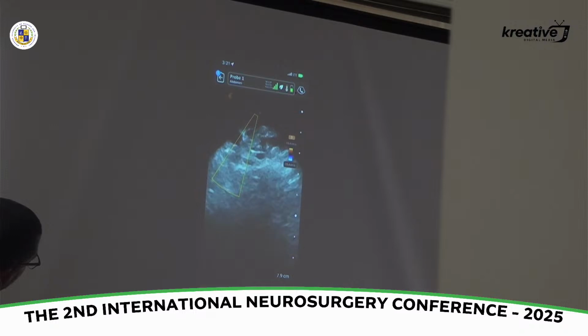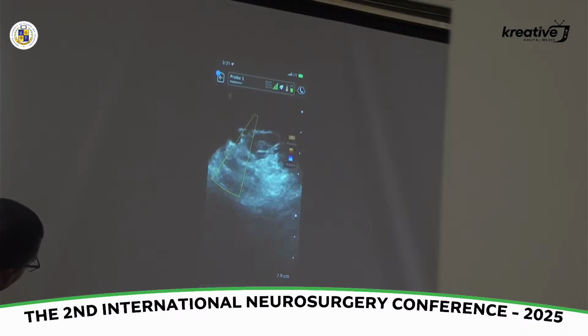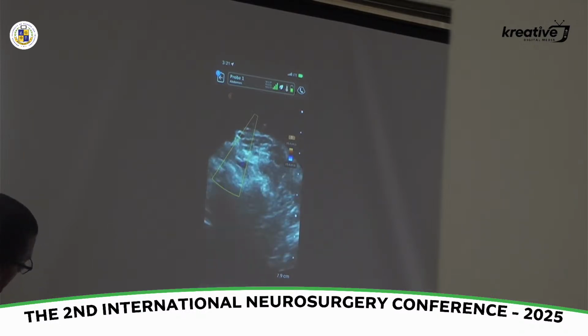I go down. There. We can get right close to the bifurcation right there. And as we go up, that's only the ICA on your left. Good.